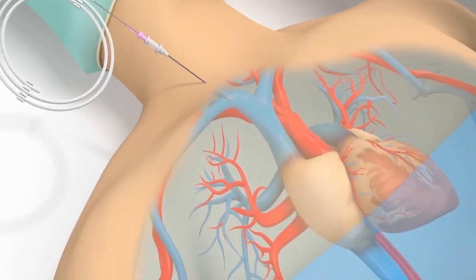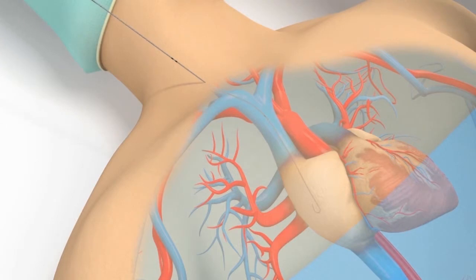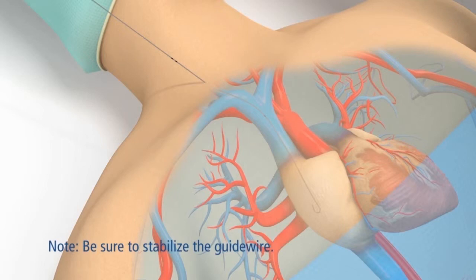The length of wire inserted will be determined by the size of the patient. Be careful to avoid contacting the heart muscle with the guide wire, as cardiac arrhythmias can occur. Once the guide wire is in place, withdraw the introducer needle, leaving the guide wire in the vein. Be sure to stabilize the guide wire to prevent further advancement or retraction.